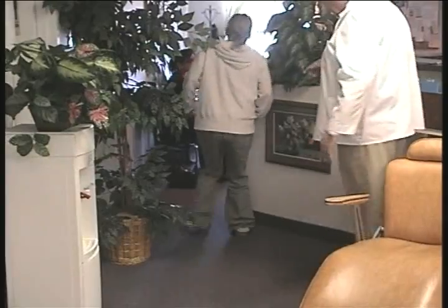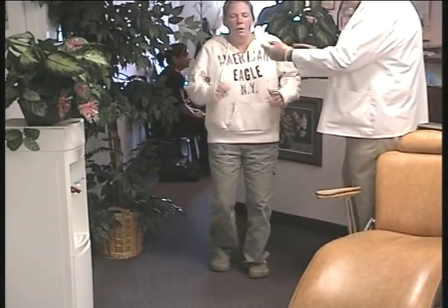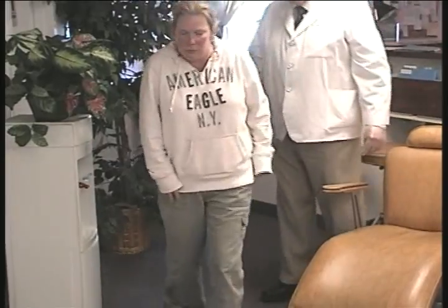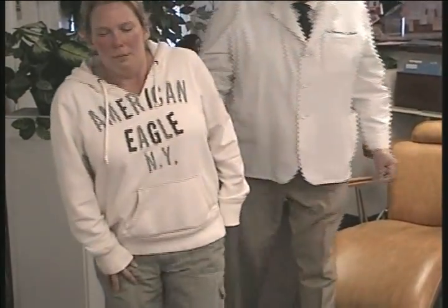Believe it or not, this is an improvement in her walking. If you did not discern any noticeable difference, notice how her walking completely degenerates when I take the appliance out of her mouth. It's not as good, is it?